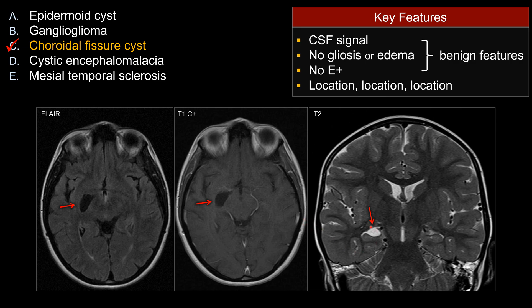The diagnosis is made based on the location. Choroidal fissure cyst is typically sitting above the hippocampus. When it gets large enough, like in this case, you can actually appreciate mild mass effect on the hippocampus. Notice that the hippocampus itself has a normal signal, and even though it's mildly compressed, it retains intact internal architecture and remains normal in volume — so there's no atrophy.